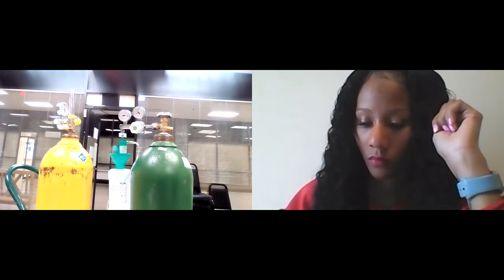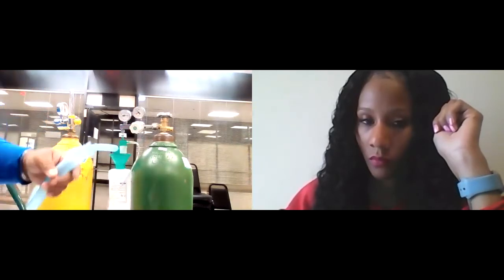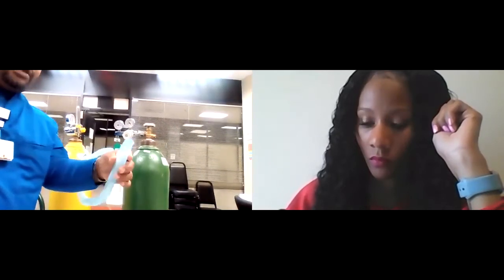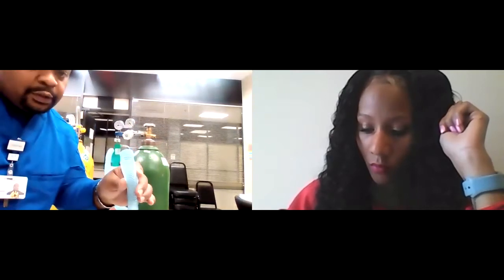All right, my first large bore tubing goes on here. It's my first large bore tubing, right? Let me scoot back a little bit. Then I need my what? What comes after the first large bore tubing? Your water bag. I want to collect that water. Let me turn this volume up. Okay, my water bag. So here's my water bag. This is my first tube in here. I'm gonna hook up my water bag.